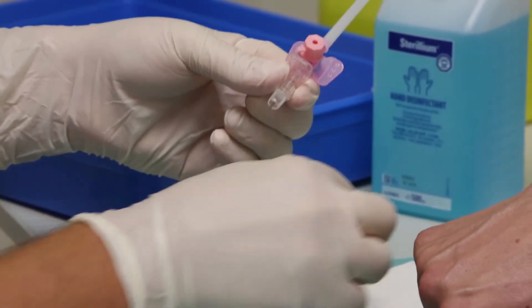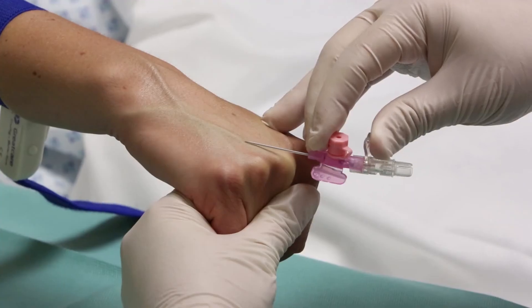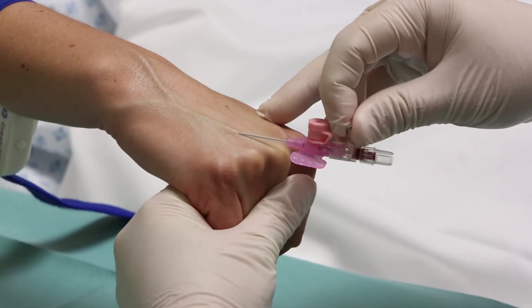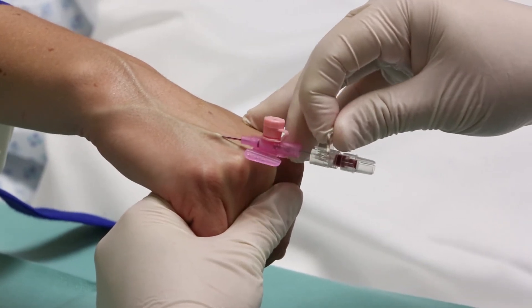Step 11. Anchor the vein below the puncture site and insert the cannula using non-touch technique. If it is necessary to repalpate the vein, the site must be recleaned before cannulation.